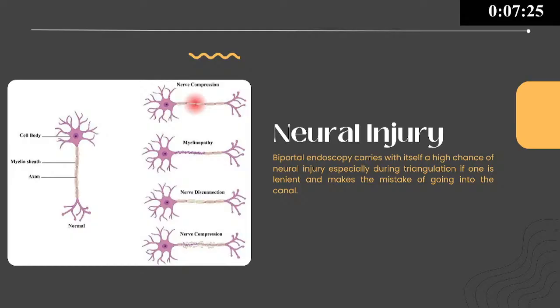Now this is a large dural tear. I finished dissecting the flavum and then I had to convert to open because I was not very well versed with endoscopic repairs at that time.